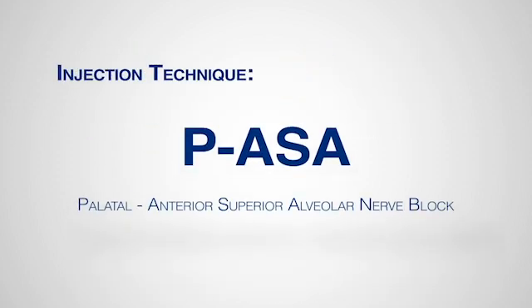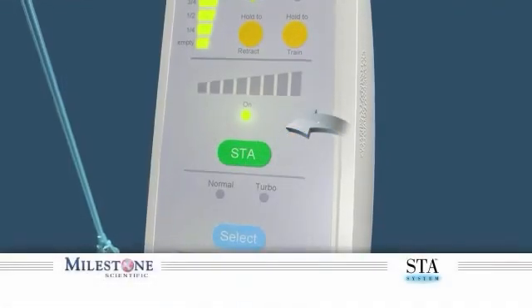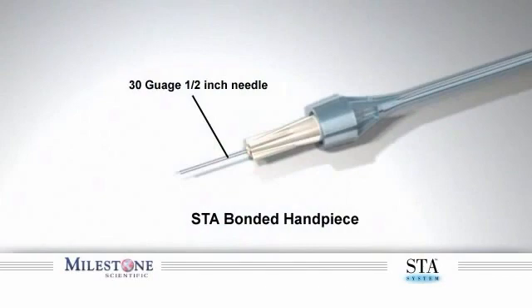Injection technique. P-ASA or palatal approach. Anterior superior alveolar nerve block. Before you begin, verify the wand system is set to the STA mode. It is recommended that you use the 30-gauge half-inch bonded wand handpiece for this injection.